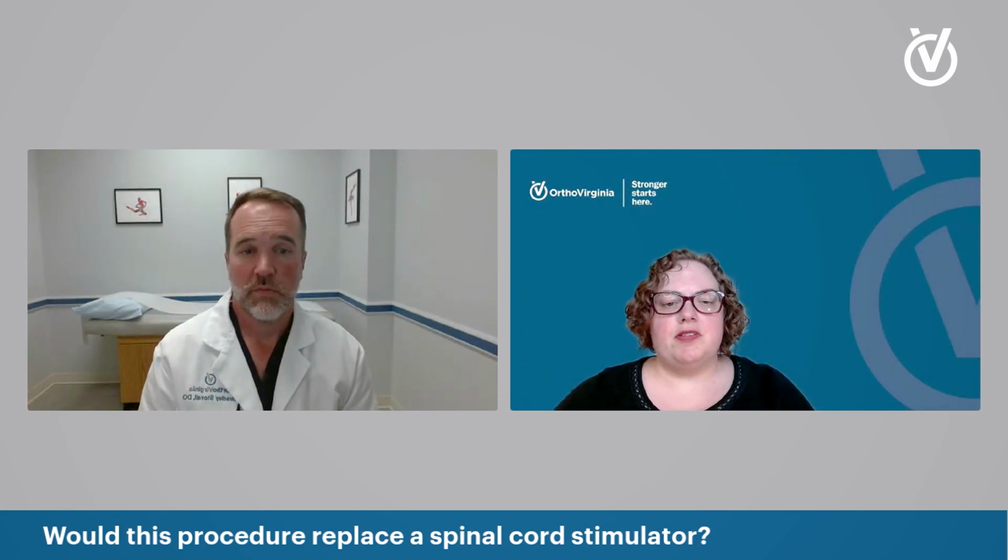Thank you. Would this procedure replace a spinal cord stimulator? That's a good question. For those of you that aren't familiar with spinal cord stimulators, they're an electrical device that can be placed in the spine to help treat back pain or nerve pain before or after back surgery when appropriate. And so think of this as treating more of the mechanical pain of the spine. Patients can often have a stimulator, say for a nerve injury or some issue with prior back surgery. But if you develop pain that's localized in the lower back region that has the appropriate imaging findings, this could certainly be used in a patient that had the right clinical picture that does have a spinal cord stimulator.